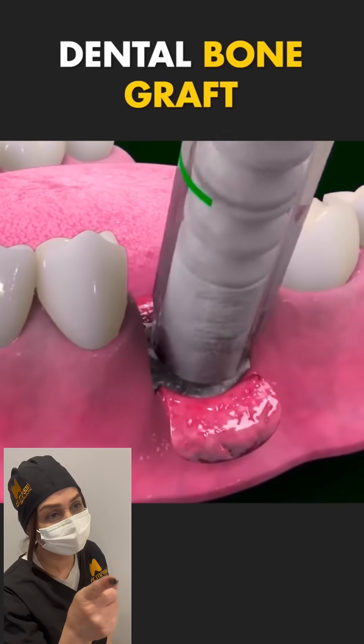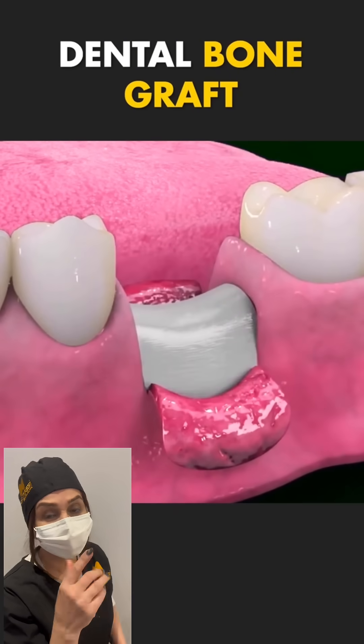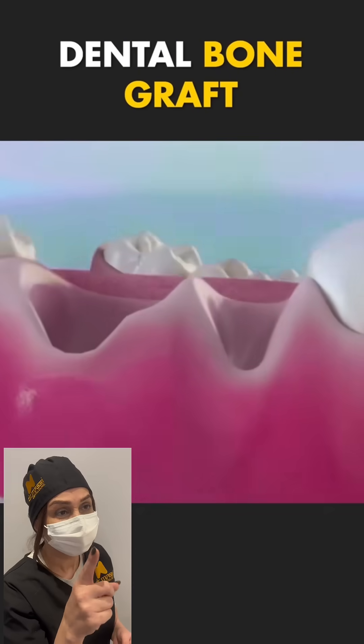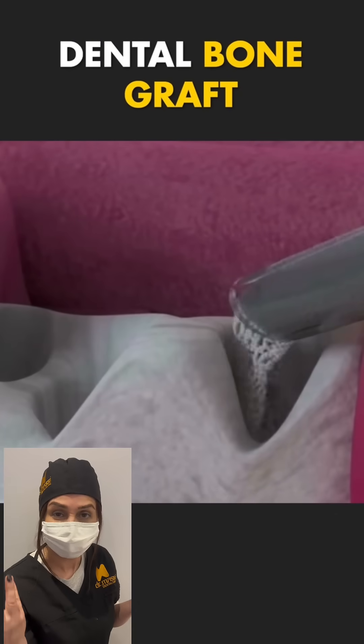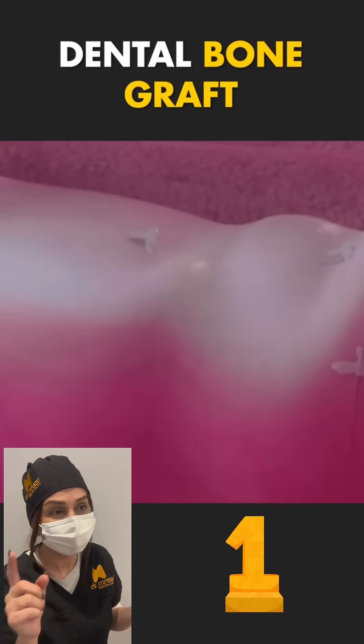Ever wondered how a dental bone graft procedure works? Let's break it down in under a minute. First, if you've lost bone due to tooth loss or disease, a graft can help build it back up. Here's how it goes.